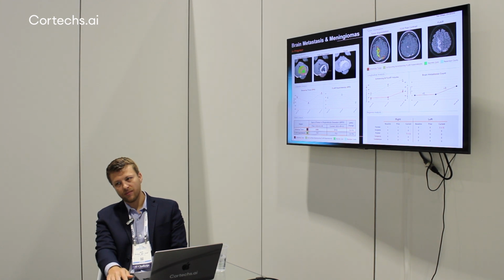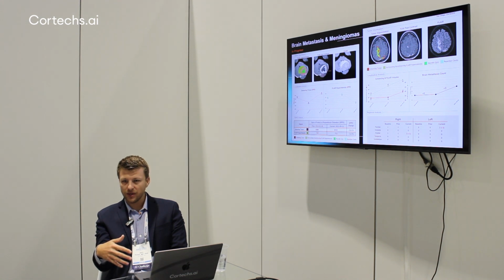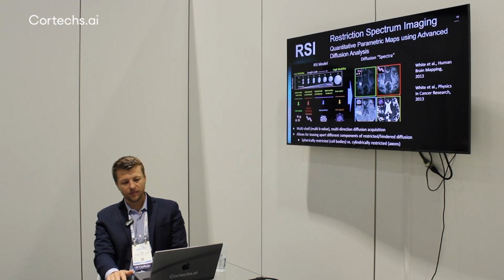As a neuroradiology fellow, that was one of the tasks that I did at UCSF. If it's just a routine assessment, you can give a gestalt of how many lesions there are and if they've changed or not. But for patients that are undergoing radiosurgery, you have to be very precise in measuring every single lesion and identifying where the lesion is, and then that gets relayed to the radiation oncologist, who then does a manual segmentation process for every single brain metastasis while they're being treated. So really, I think there's a lot of potential to facilitate workflows for radiologists and radiation oncologists by having a brain metastasis product.